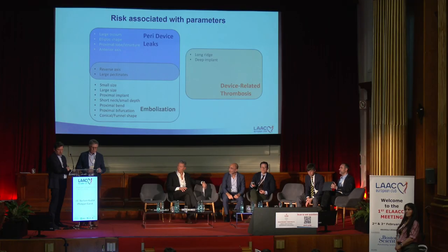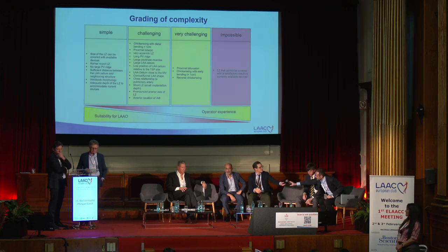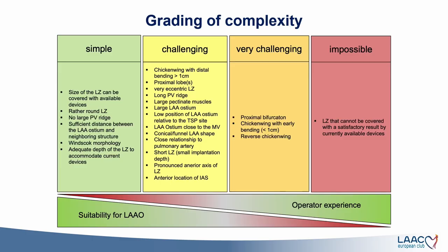I think we really want this to be a clinical, useful classification as the primary goal. And for me, it should really reflect how we think when we try to pre-plan a LAA procedure. When we go through a CT data set, we will look at the orifice. Is it large? Is it oval? Is it small? Is it low? What is the landing zone?